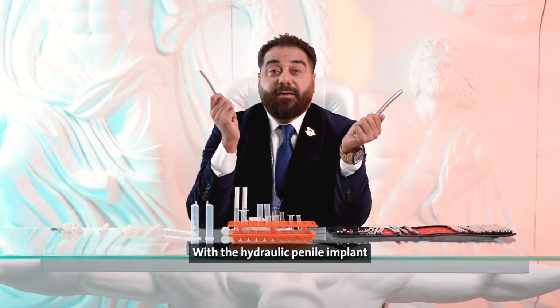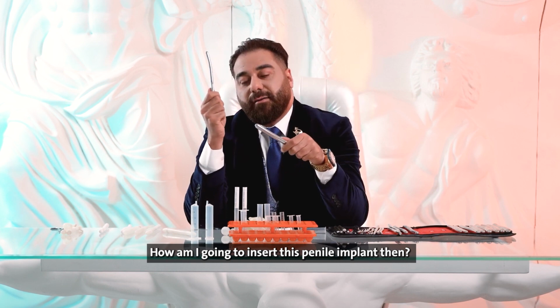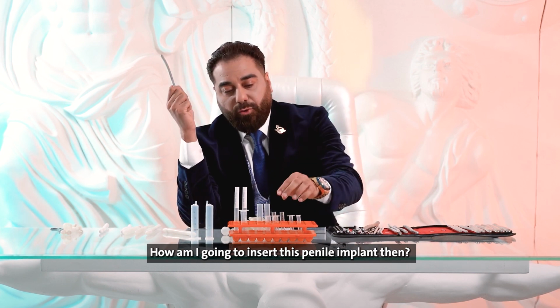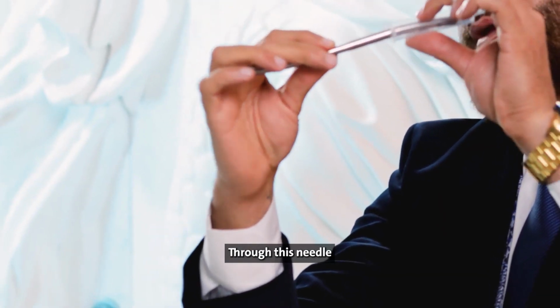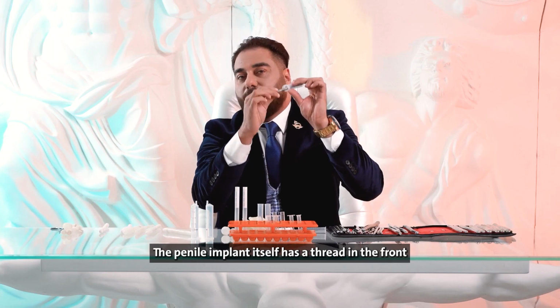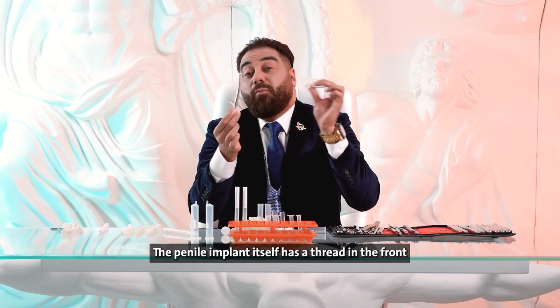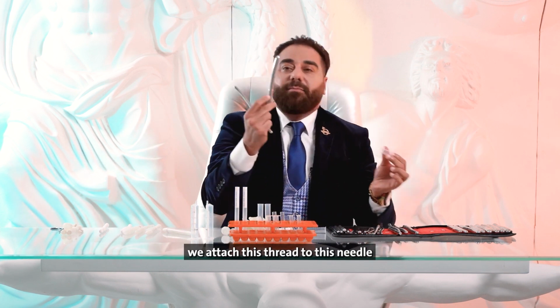With the hydraulic penile implant, I just need to insert a dilator like this. How am I going to insert this penile implant then? It's as I told you, it's hollow. How do we insert it? Through this needle. This is the needle that we use to insert the penile implant. The hydraulic penile implant has a thread in the front. Why? To pull it up. During the procedure, we attach this thread to this needle.